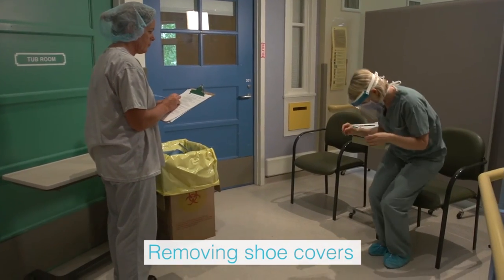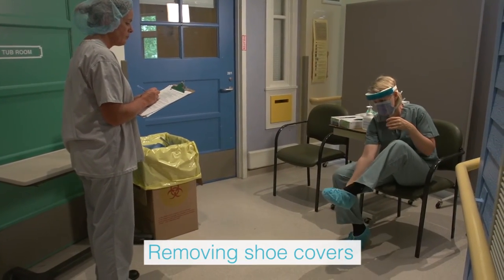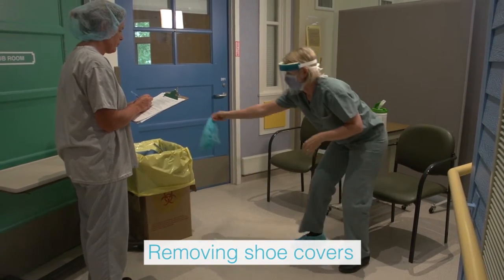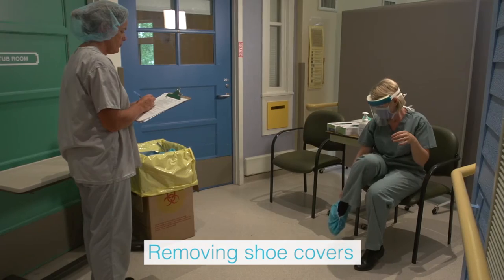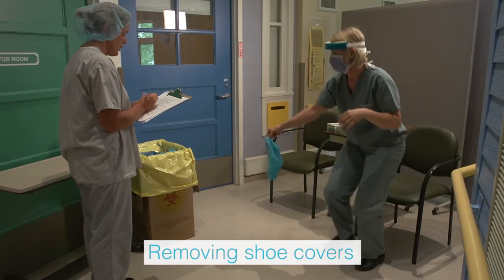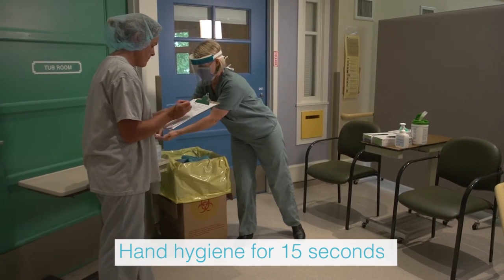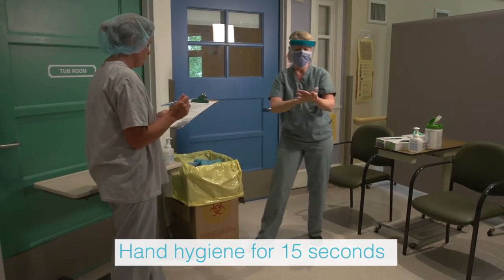The trained observer removes the shoe covers slowly and carefully by lifting the heel of the first foot and then the toe. The shoe covers are discarded in the waste receptacle. Perform hand hygiene using alcohol-based hand rub and allow hands to dry completely.